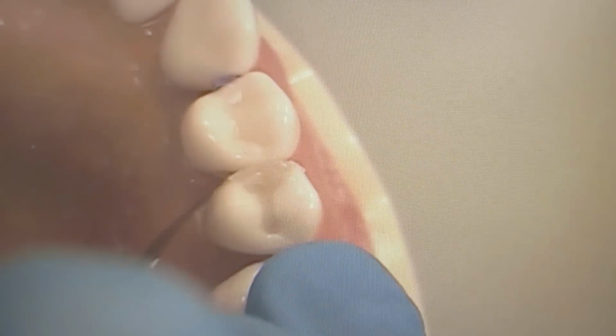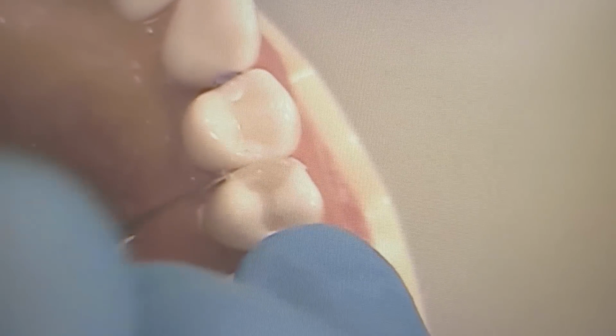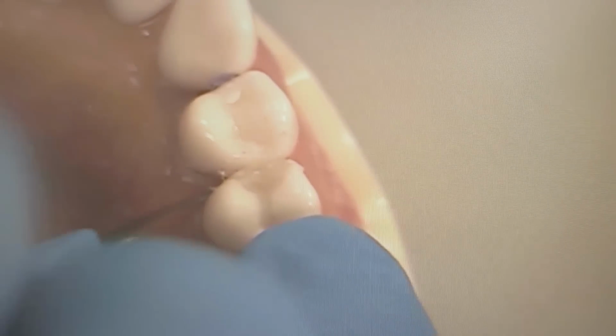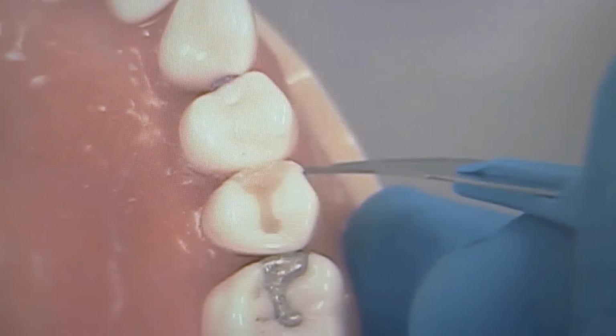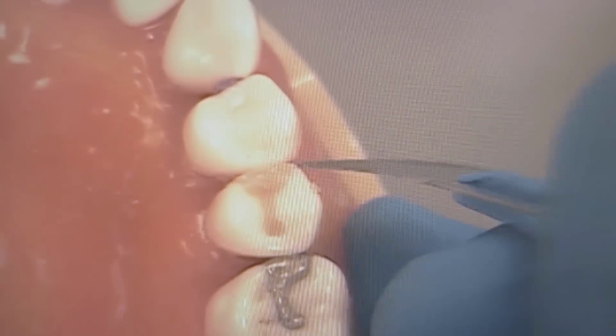This is slightly over contoured now, so using the 12 blade to remove the over contour and excess flash. If you take a look, it is based on where you place your wedge, the placement of it and where you want it. You see, smoothing out the shape of it.